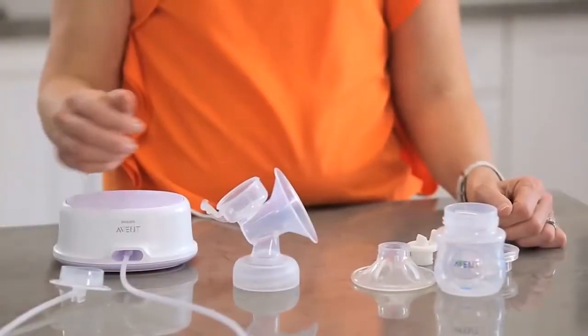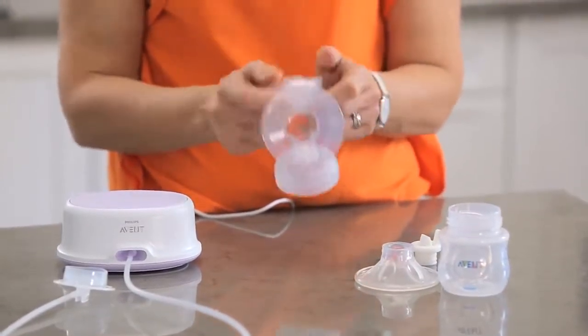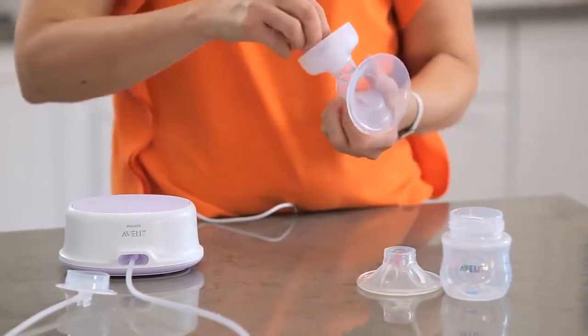Grab the tubing and take hold of the disc at the end. Place the disc over the diaphragm on top of the pump body like so. Now press down around the whole top of the cap to ensure there is a firm seal.